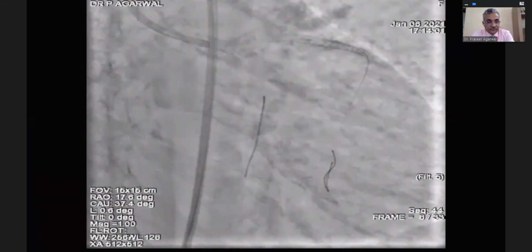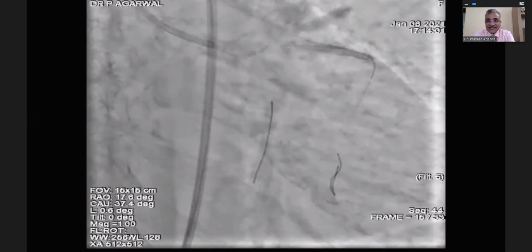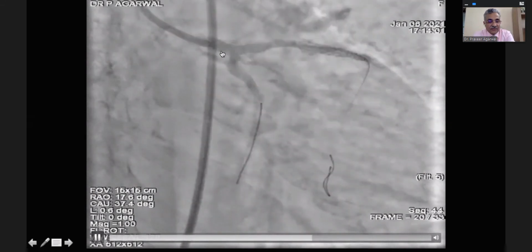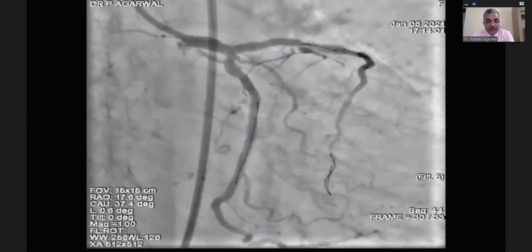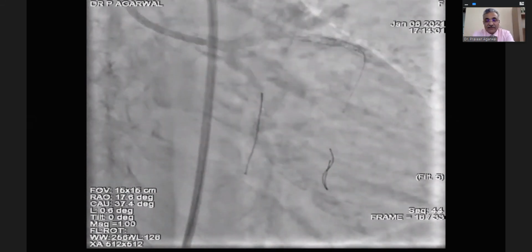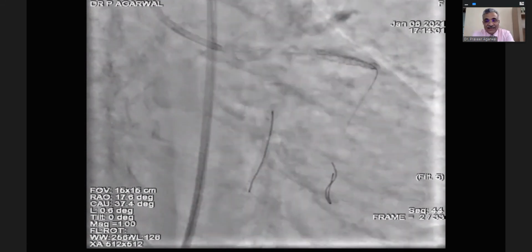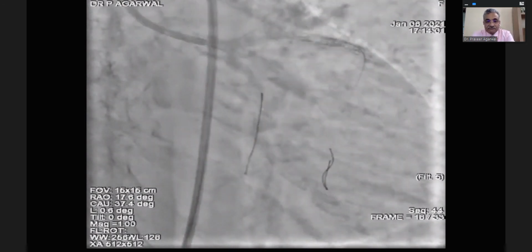It was looking reasonable. Though it looks properly underdeployed, this was done in January and we left it because this was still around maybe 4.75 or nearly close to 4.9 at the proximal edge. So we left it there and till now she's doing fine. But supposing the OCT was not there, I would have gone easily to a 5.5 balloon at the proximal edge because the stent will take about 5.7. So I did not do it seeing that. The lady is clinically doing fine. I saw her last month, she's doing all right. So I left it there.